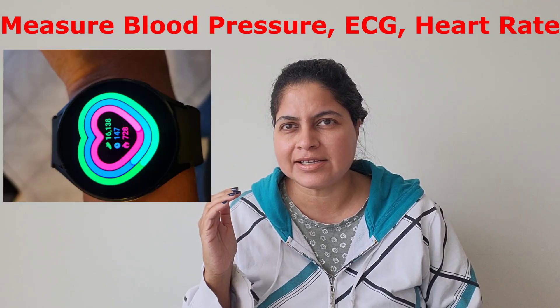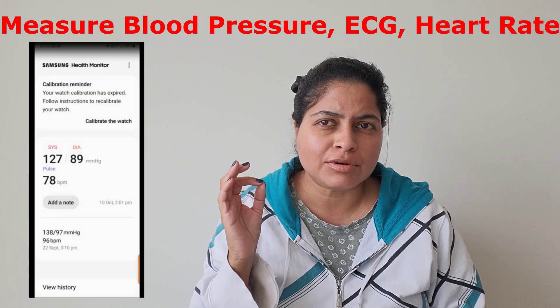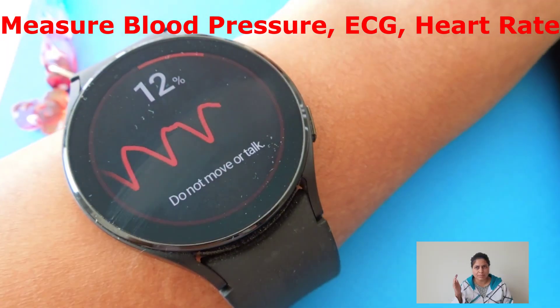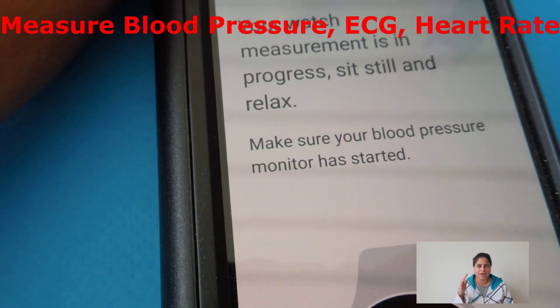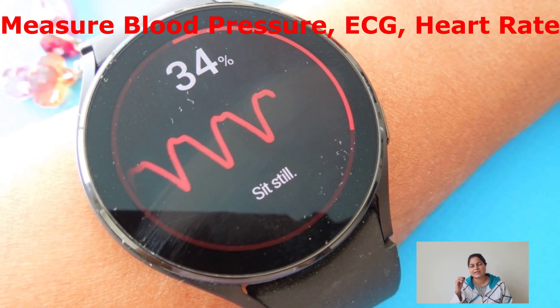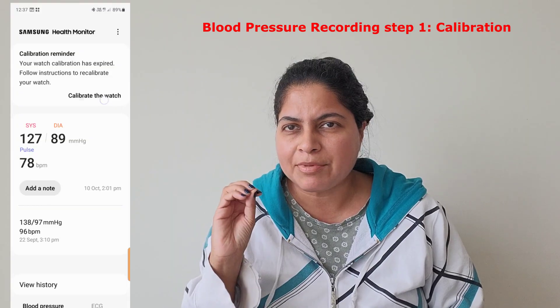In this video I'll be using the Samsung Galaxy Watch and the Samsung Health Monitor app to measure blood pressure, ECG, and heart rate. Even if you own any other brand, continue watching because most brands use the same sort of functions and navigation, so it will give you an idea of how to measure blood pressure, ECG, and heart rate using your own watch.